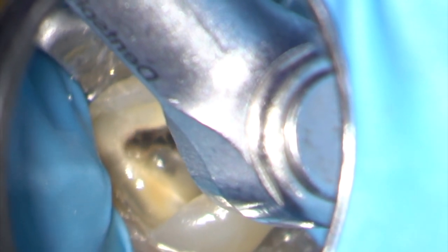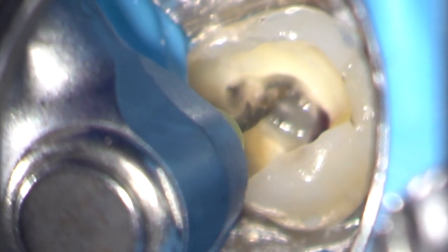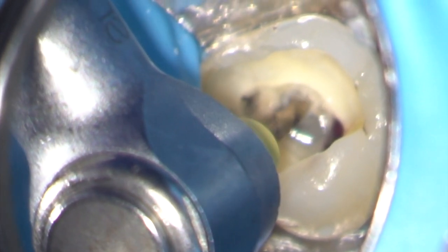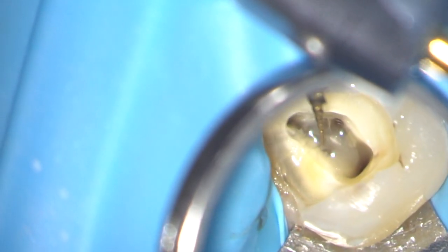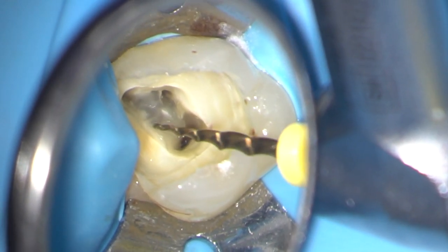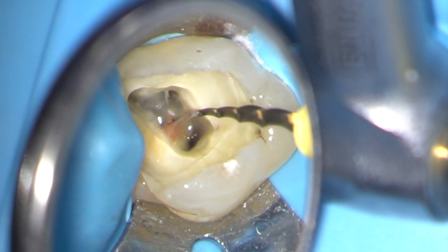Preliminary coronal flaring is carried out using a ProTaper SX instrument, but you could also use Gates Glidden burrs or other rotary files. The MB2 is approached from a palatal direction, as it often converges with MB1.